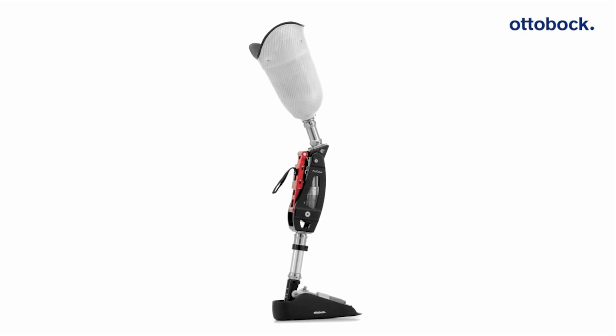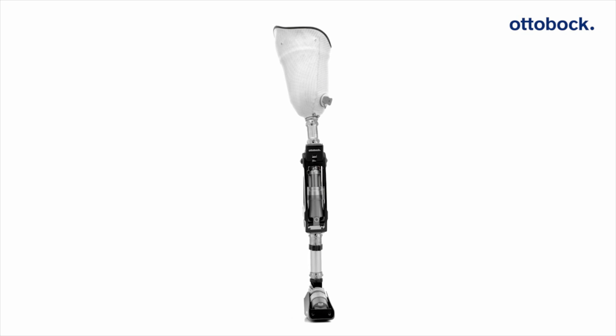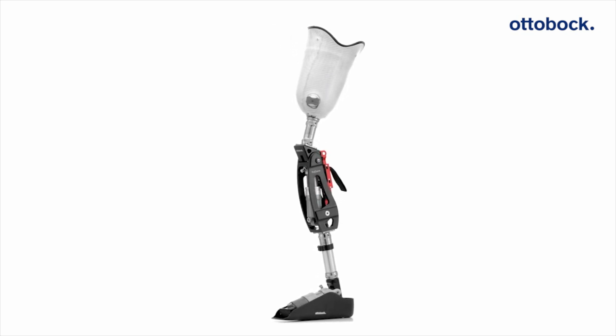The foot and knee combination is suitable for knee disarticulation and above-knee amputees, while below-knee amputees can take advantage of the ProCarve foot component.